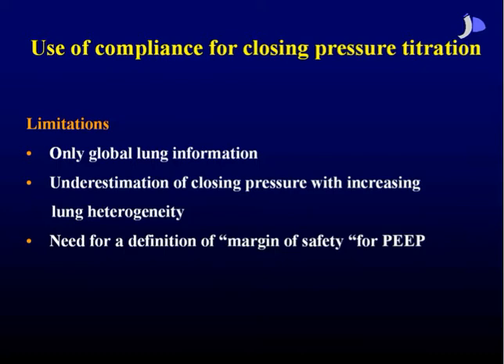Well, I'm afraid I don't have a definite answer to that question. What we know is that the very high pressure is only to be applied in the sickest patients. And I think the maximum benefit of a recruitment strategy is when you apply it early in the course of ventilation, when you don't have to use such high pressures. And normally with 45, 50 of pressure, you have excellent recruitment. You can get rid of all the atelectasis, and your PEEP level is not that high.